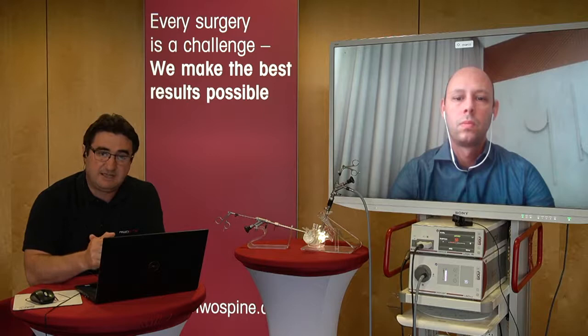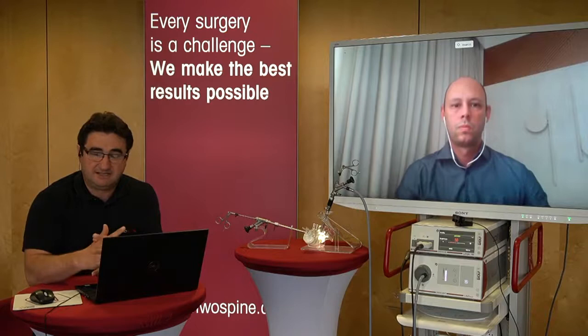But just for posterior decompression over the top or ipsilateral, it's really good to work with the stenosis system. It's really faster.